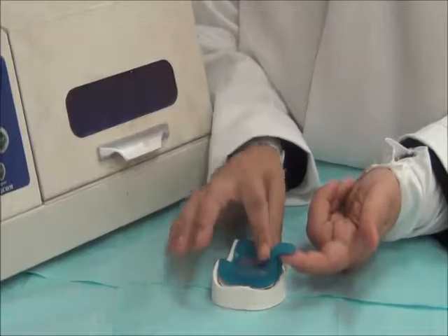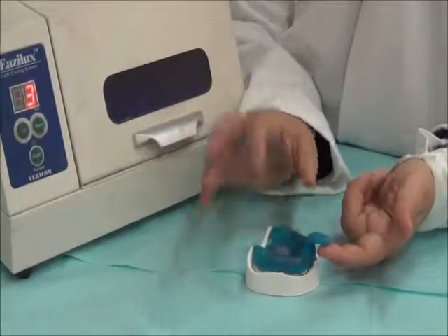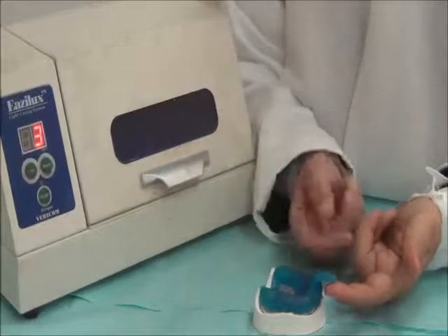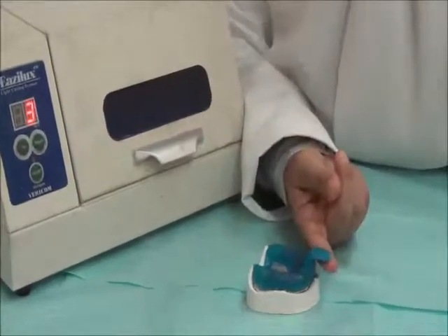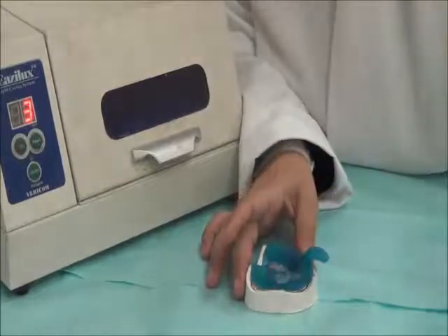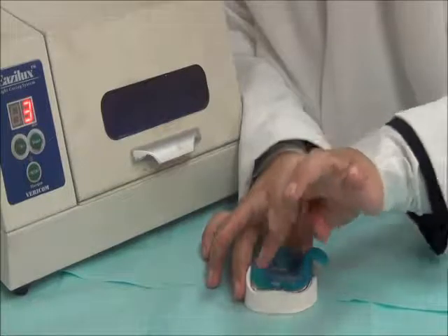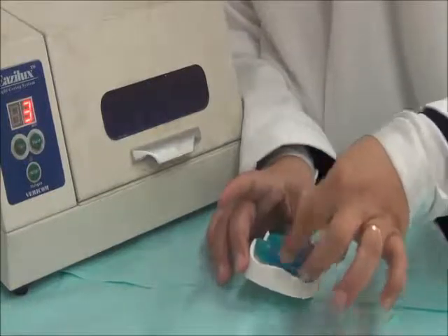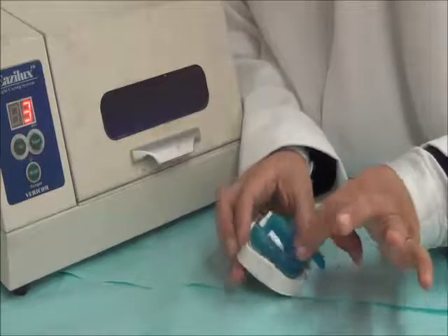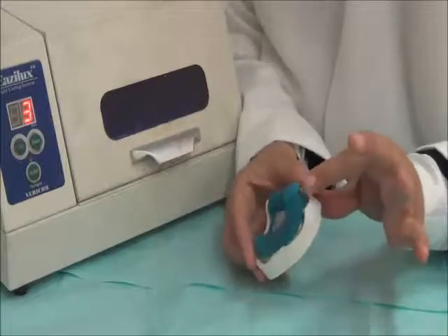Another issue is that the light cure acrylic material has what we call an air inhibited layer. This layer does not fully set on the surface because of its contact with oxygen. So we could add Vaseline to the surface. This will reduce the air inhibited layer, and Vaseline will also aid in the fusion of the body of the handle to the tray material.